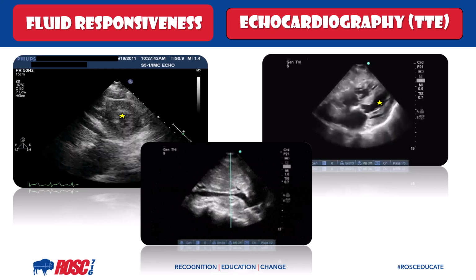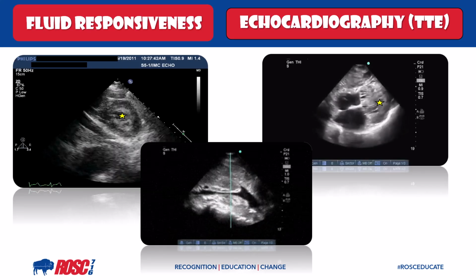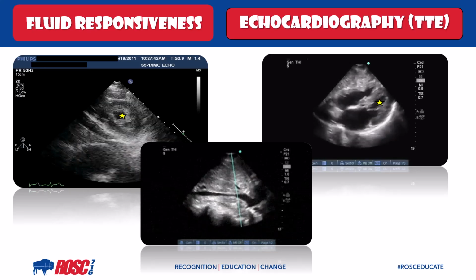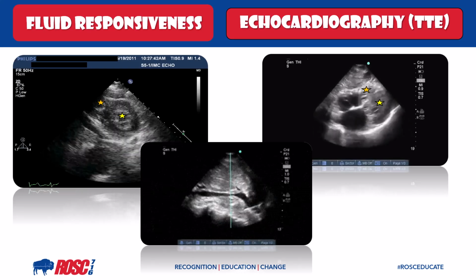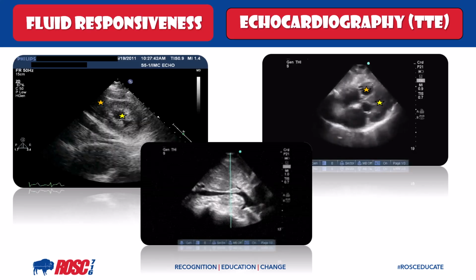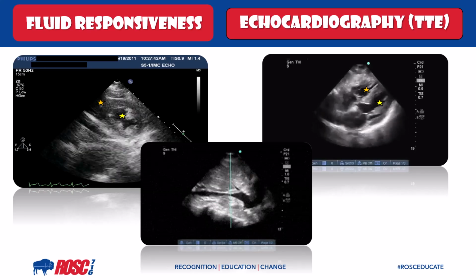I'll first point out here the LV, the left ventricle. In both of these windows, you can see that the papillary muscles in the ventricle walls are actually kissing themselves. This is a hyperdynamic left ventricle, and it gives a perception of a low left ventricular end diastolic volume or area. Also to note is the RV. So in the parasternal short in the left upper image, you barely can see it. In the subcostal image, you can see that it is hypercontractile and is not dilated. And then lastly, in the IVC window, you can see that you have a grossly small IVC, and what volume is in the IVC seems to be variable in relation to respiratory pattern.